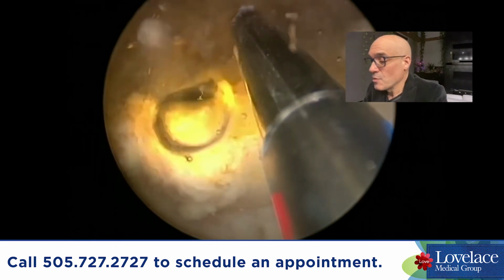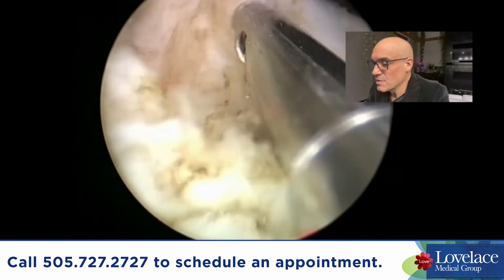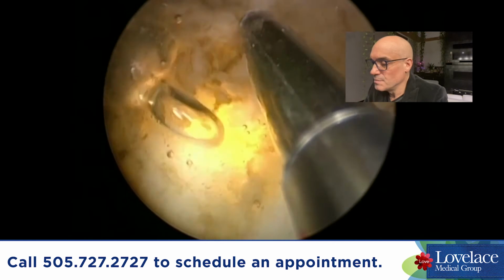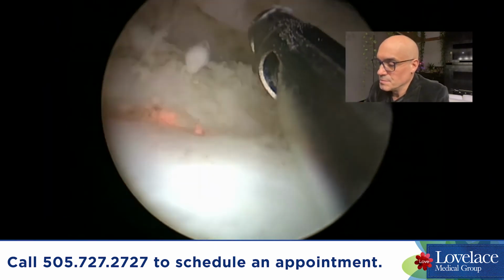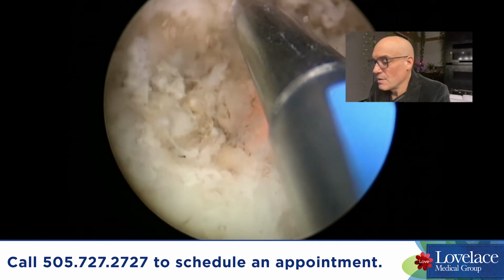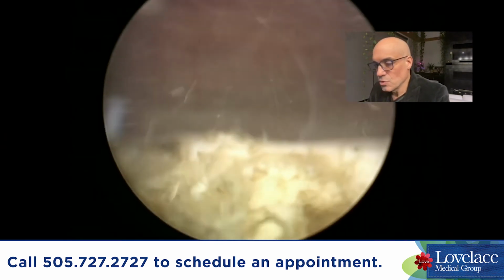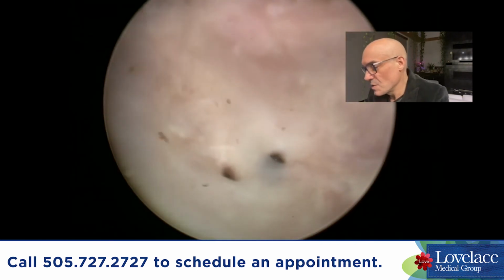The laser fiber is sticking out in front of the scope, and you can see as the laser hits the tissue, it ablates or vaporizes it, and causes basically coagulation of the blood vessels. So there's not a lot of blood loss, if any. Now, it does have a different mode. If a blood vessel is encountered, you can use this special pulsatile mode of the laser, which helps coagulate.